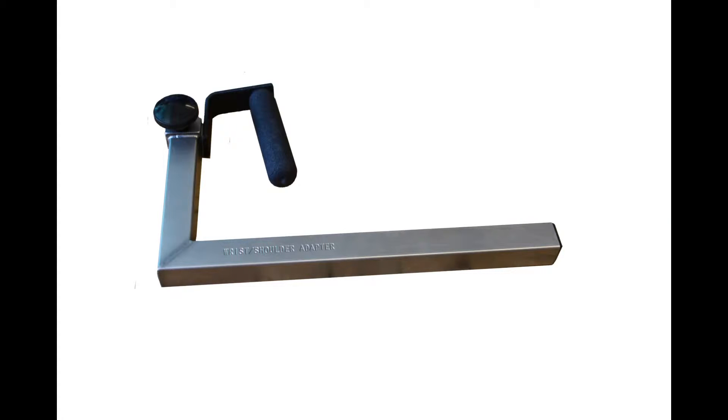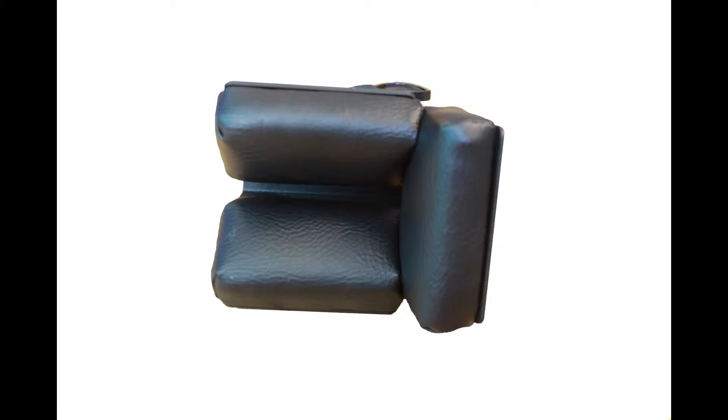We will need the wrist shoulder adapter and the elbow stabilizer pad.